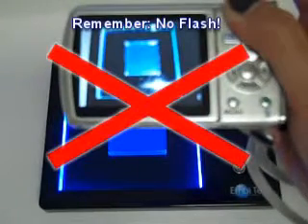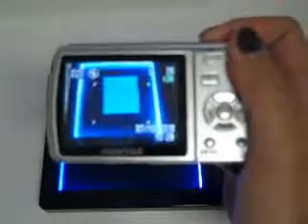Remember, no flash. Flash will cause blurriness or poor band visualization. Here's our picture.